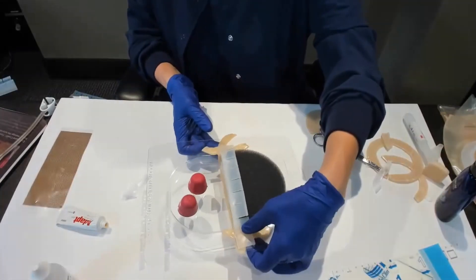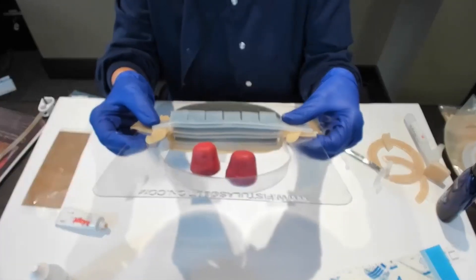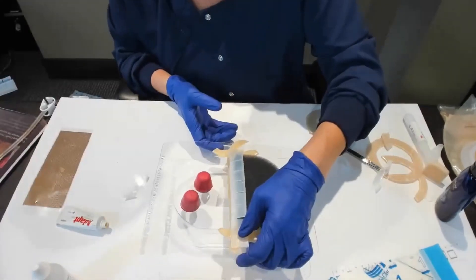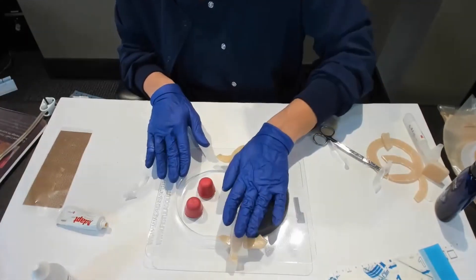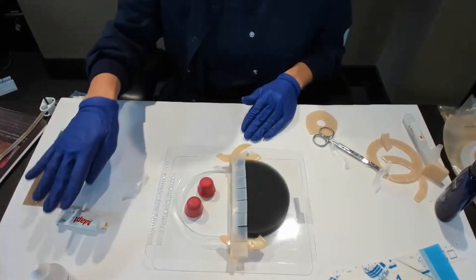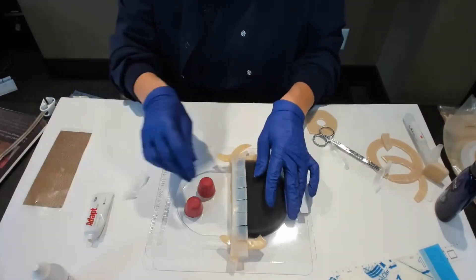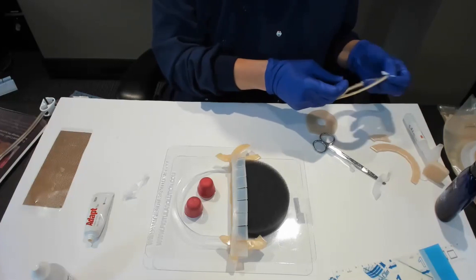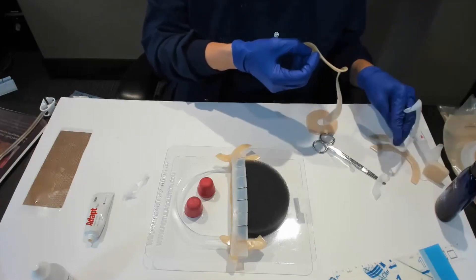I'm really trying hard to make sure I have all those little edges all sealed off. In this particular case, you're going to want to use stoma paste also. I like a barrier ring on the top as well. These are not easy cases.